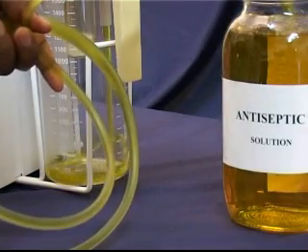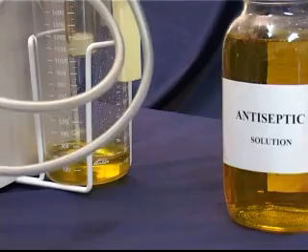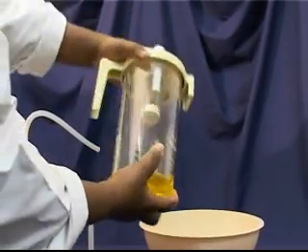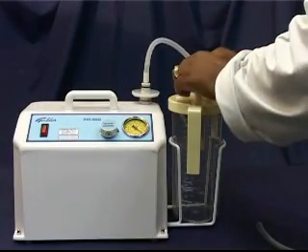Now, fill the jar with 200ml of antiseptic solution. Fit the bottle properly to the cap and rinse thoroughly. Now, reconnect all tubing.